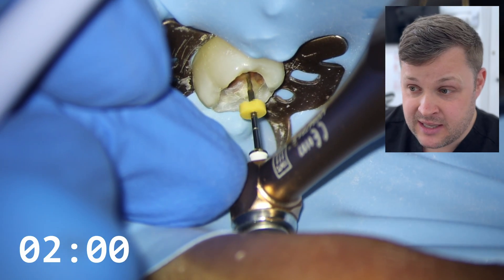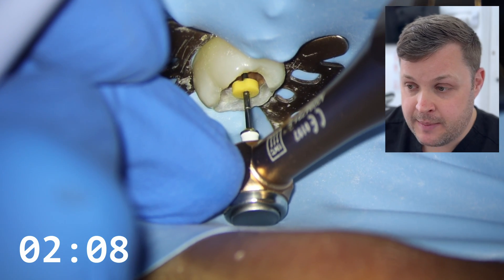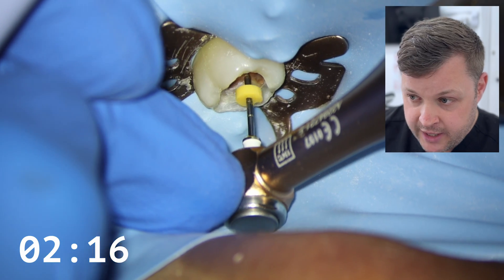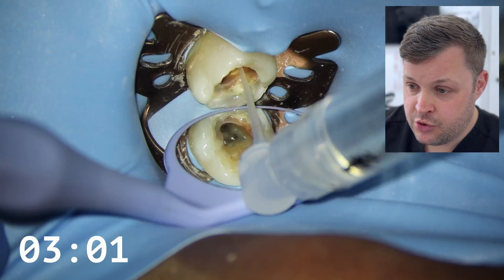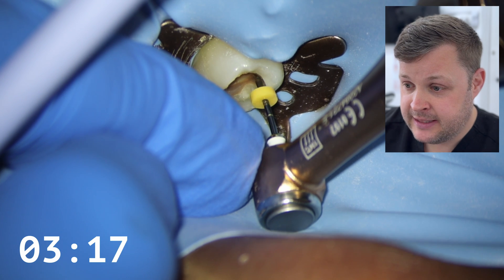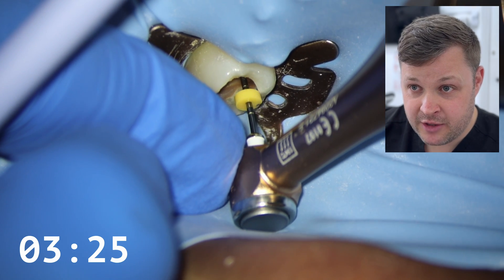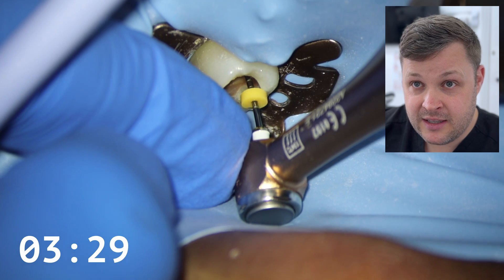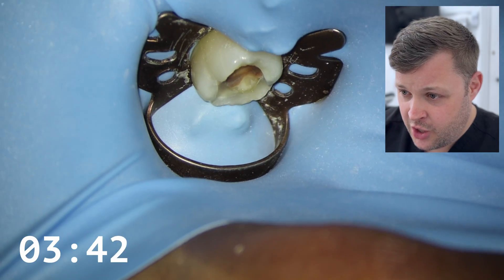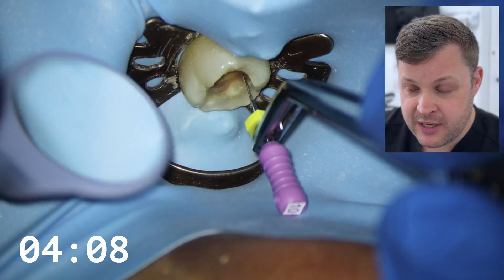Now I'm using a HyFlex 15/04 in the canal — remember, I haven't used any glide path file beyond the size 10 K-file. I'm just letting the HyFlex 15/04 bring itself further apically, not pushing any apical pressure — notice my finger is just to the side. We're doing lots and lots of irrigation, which is really really important. I'm going to do a second pass to ensure the canal is patent. We got a zero reading on the automatic apex locator on the first pass, and now the second pass confirms the measurements so we know the length of the ML canal. Then I recapitulate with the size 10 K-file to make sure the canal is still open.